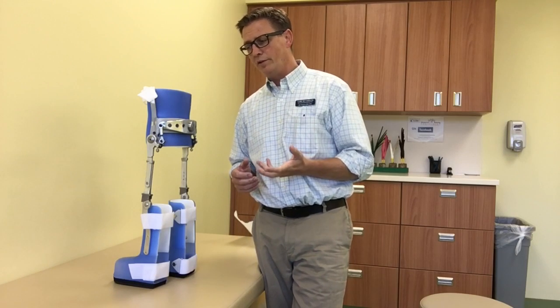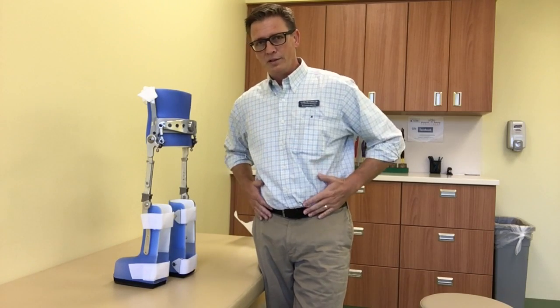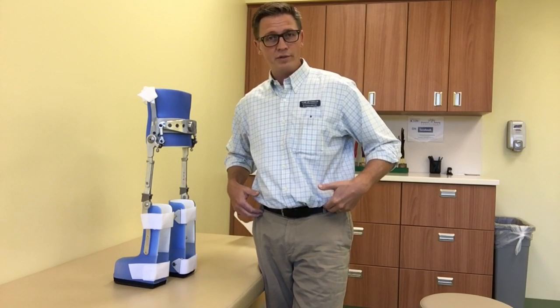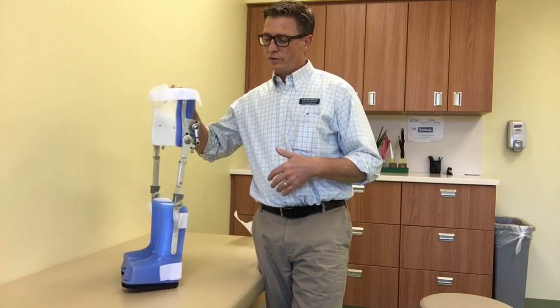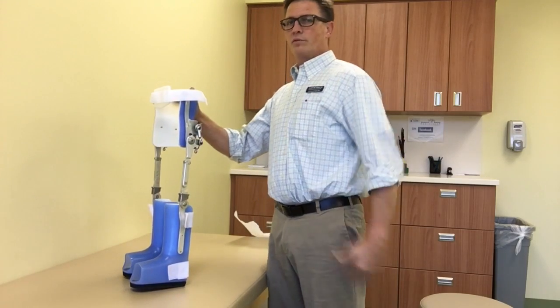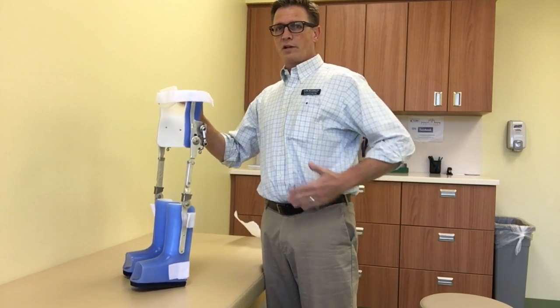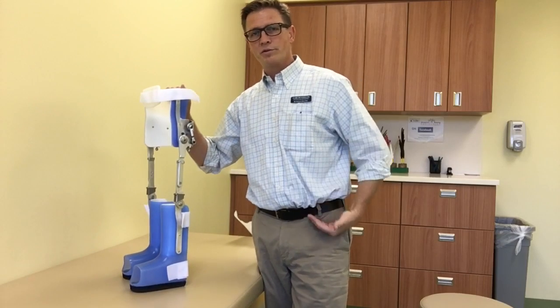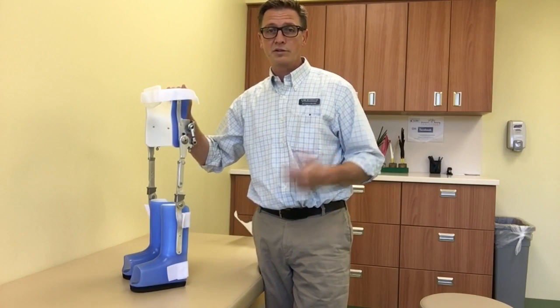One other benefit we see is that kids, typically with spina bifida, who spend a lot of time in a wheelchair will get hip flexion contractures. This brace stretches them out totally — keeps their legs straight, their trunk straight — and holds the trunk back with the pad up here to help stretch those hip flexors and prevent contractures from developing.